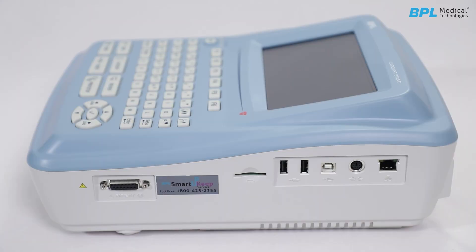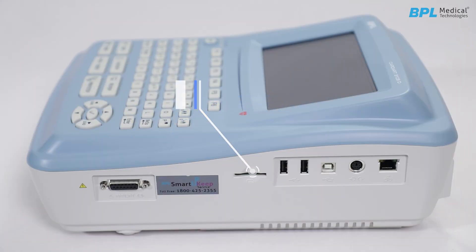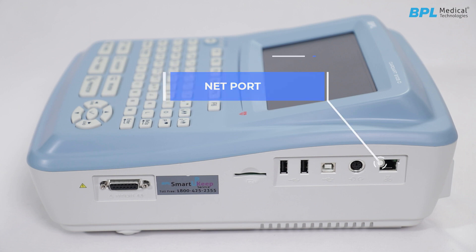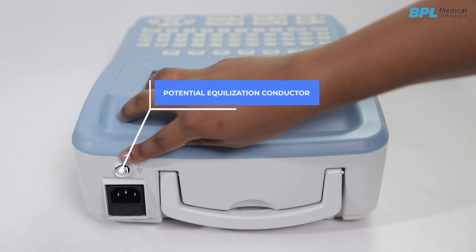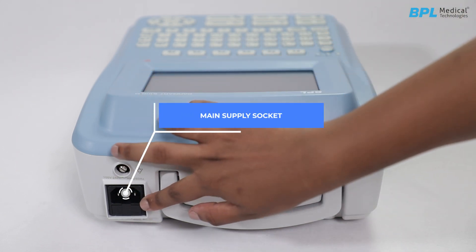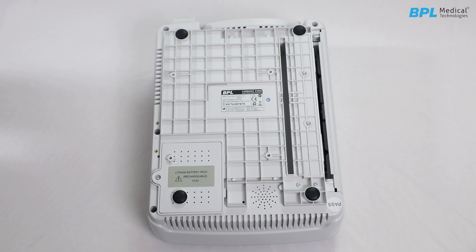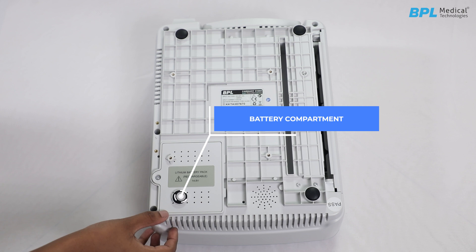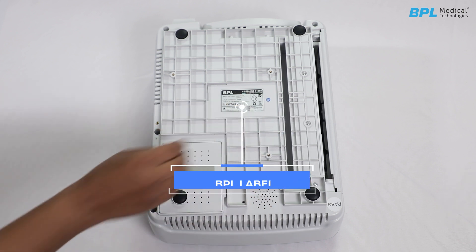At the right panel, there is a patient cable socket, SD card, USB-B type, USB-A type, external input/output socket, and a network port. At the rear panel, there is a potential equalization conductor, main supply socket, and a handle. At the bottom panel, there is a battery compartment, speaker hole, and a BPL label.